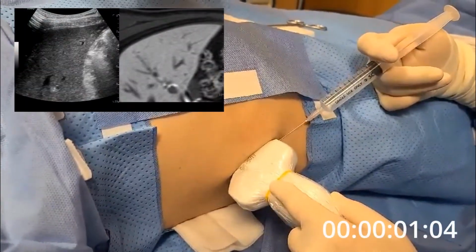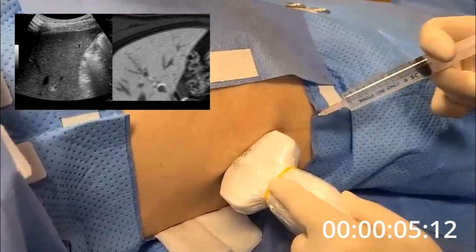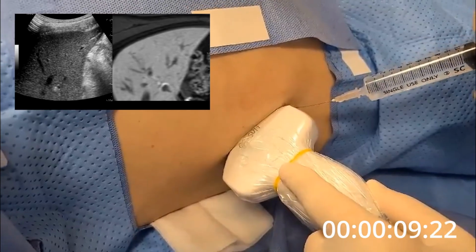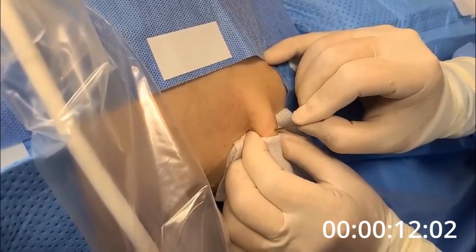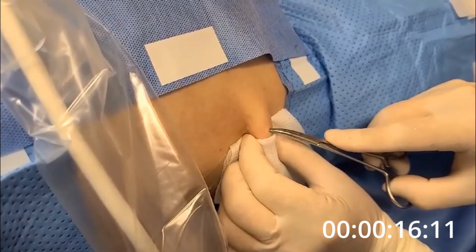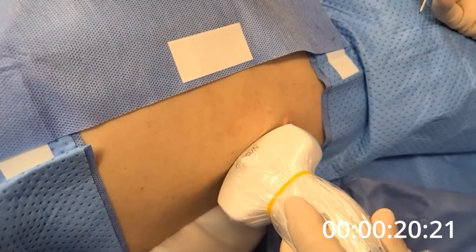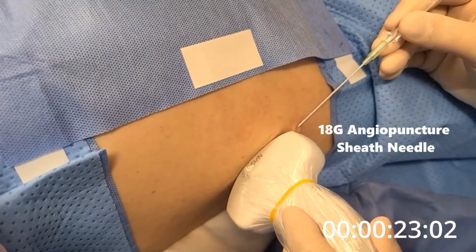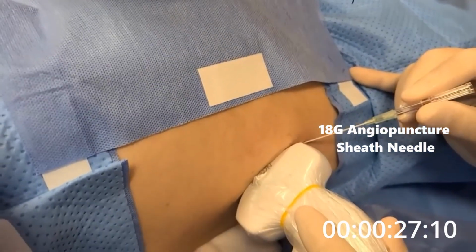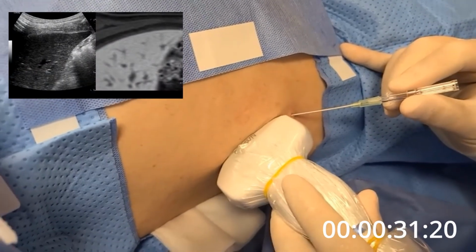After skin and peritoneum anesthesia, I use an 18-gauge angiopuncture sheath needle to select the peritoneal space.